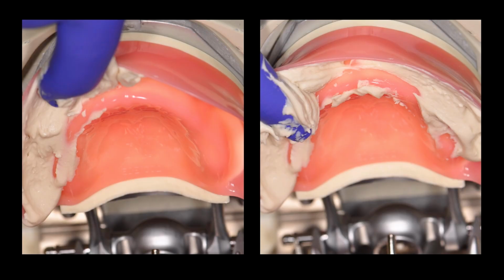Now, this is the part that's going to be a little messy. I always advise students to let your patient know what to expect during this time, okay? So remember that extra alginate that you placed on your left hand when you were mixing alginate and applying it to your tray? You're actually going to need it now. You'll be using that extra alginate to fill in the vestibule, and you're going to have to apply some pressure while you do this. If you don't, you're going to create voids within the alginate, and you're going to have to retake your alginate impression. So fill in the vestibule, apply a little bit of pressure all around.